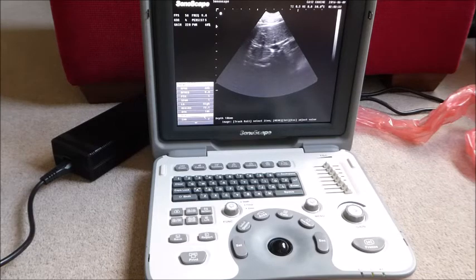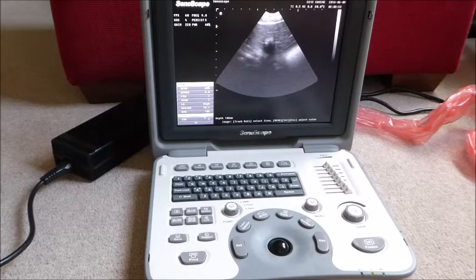So again, I would just leave it how it is right now, but if you ever encountered that problem where you did have a dog that was sort of hyperventilating, which does happen sometimes, they do pant a lot, and your image was just too blurry and you couldn't get anything, then you might want to change that again. Similarly, some people have dogs that just fall asleep when they're scanning, and you might be able to change the persistence so that you get a really beautiful image and there's not much movement going on, so you're not going to encounter any problems with a sort of a laggy or unresponsive image. So that's another thing you can play with eventually.